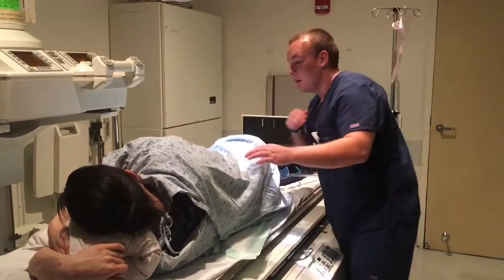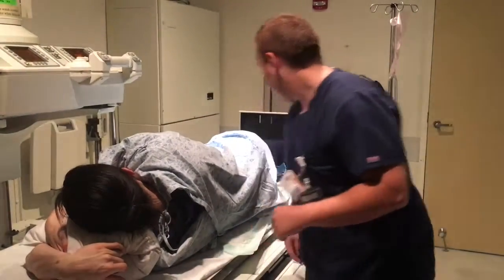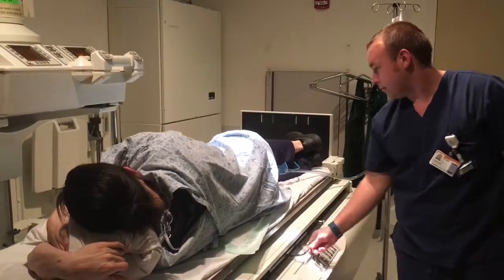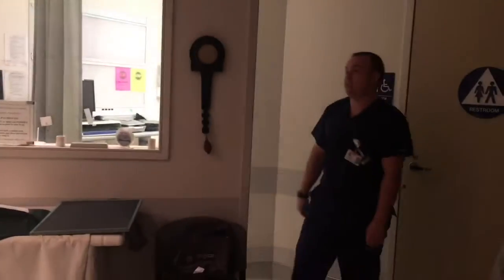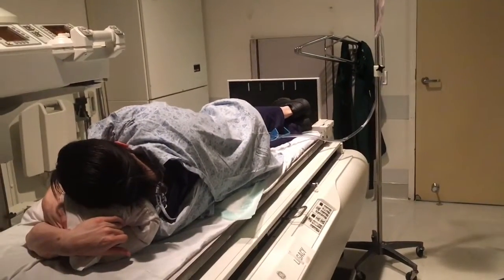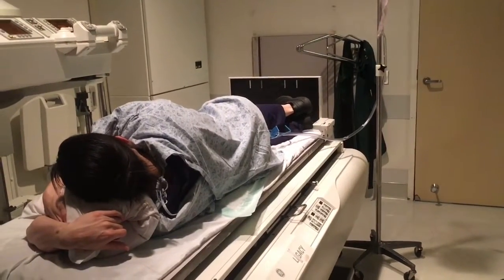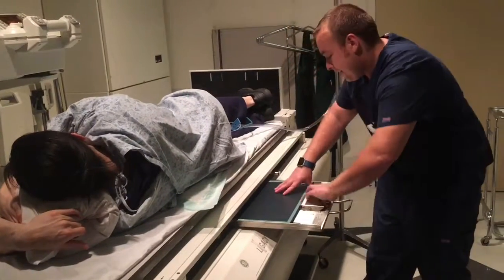Alright, looks good. Got my marker on there, yep. Alright. Technique's going to go up to 90 at 60. Taking a deep breath. Blow out. Hold. X-ray. Alright, go ahead and breathe. We'll scan this one.